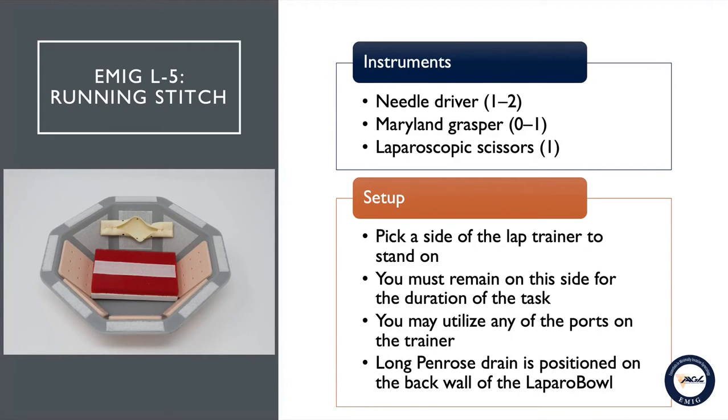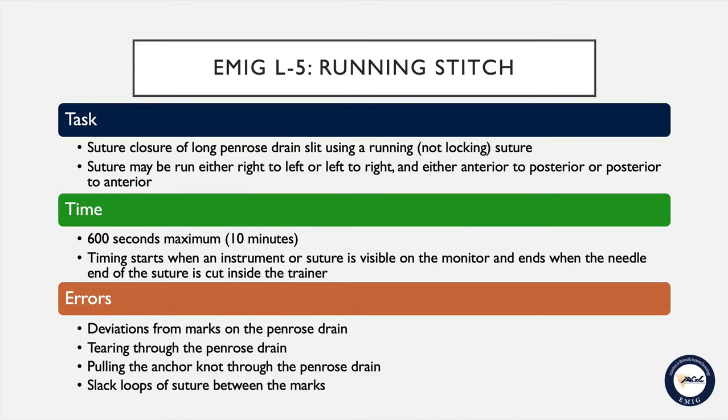You may utilize any of the ports on the trainer. The long penrose drain for this task will be positioned on the back wall of the lap bowl. You will be provided with a piece of suture that has been cut to 20 centimeters in length with a pre-made anchor knot at the 18 centimeter position on a curved needle. You will use this suture to close the opening in the long penrose drain using a running suture that is not locking.